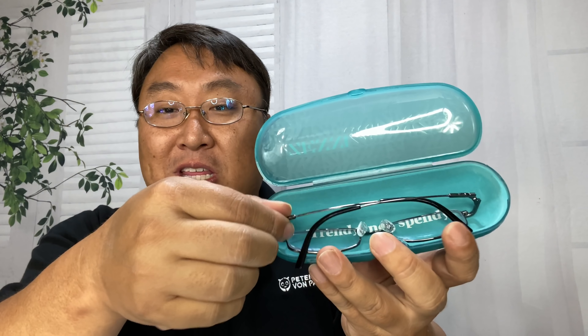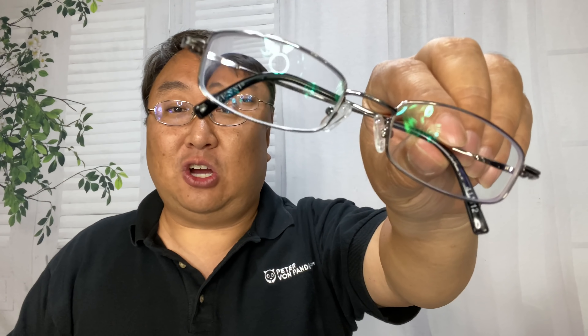So now if you've done both of these things, you have the numbers you need to order the lenses and the pupillary distance. You can go onto a website like Zenni or any of the other online glass manufacturers, put in the information, shop around for the glasses you like, and order them. I went ahead and did that from Zenni.com.